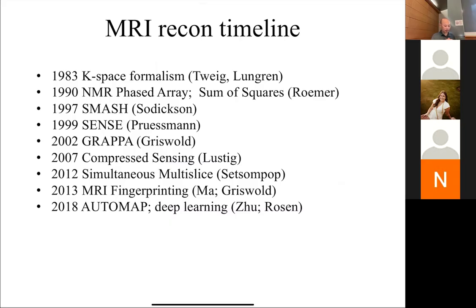And then what happened is in the 90s, I think Dan Sodickson was a graduate student, postdoc. Okay. A few really smart grad students and postdocs came up with a new way of doing MR, which we're going to talk about. And this is all under what we're going to call parallel imaging. Okay. And this was the first major revolution in going away from standard Fourier reconstruction. And now, if you get an MRI done, you're going to have parallel imaging. It's now standard on all systems. So this was a really big deal.